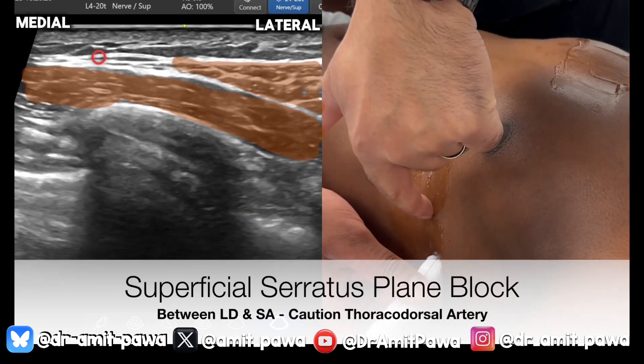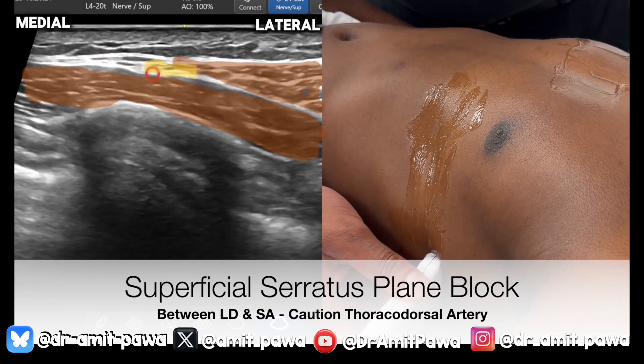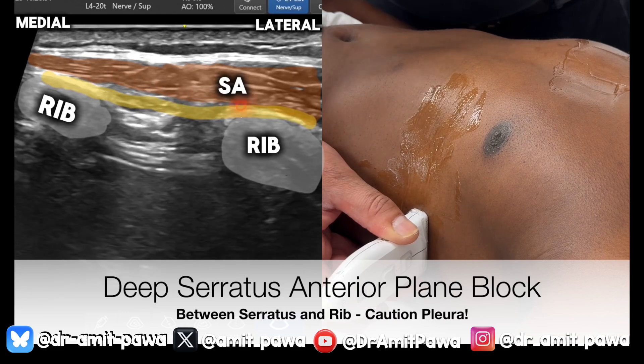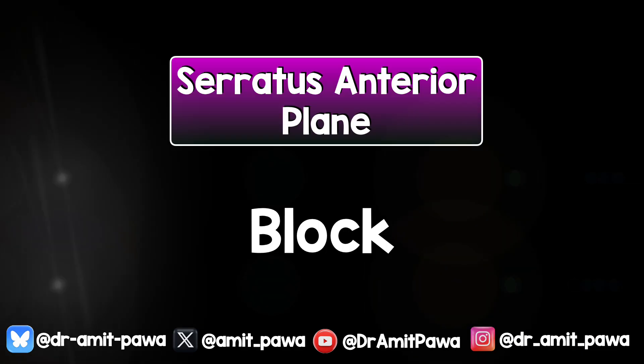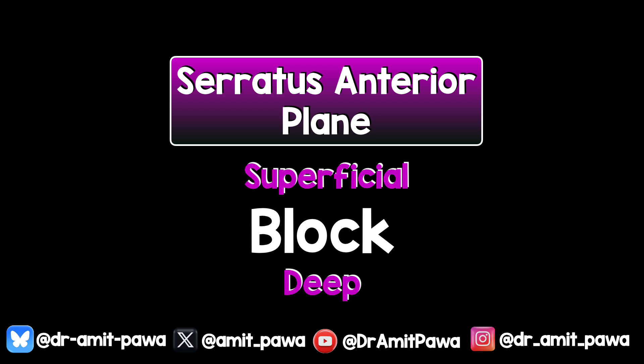The superficial serratus anterior plane block involves injecting local anesthetic in the gap between LD and serratus — you need to hydrodissect out that plane. The deep serratus anterior block involves injecting local anesthetic deep to serratus, using the rib as a stopgap and lifting serratus anterior up and out of the way of the ribs. The deep approach is now my preferred technique. I'm going to show you both the superficial and deep approaches.